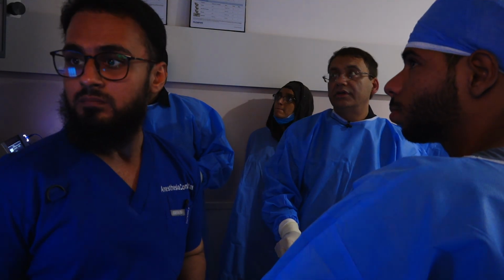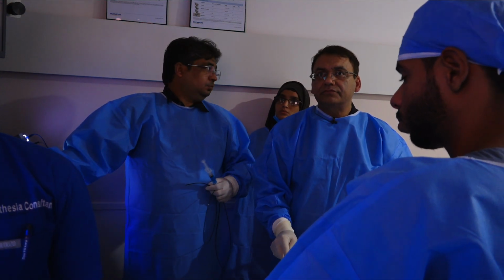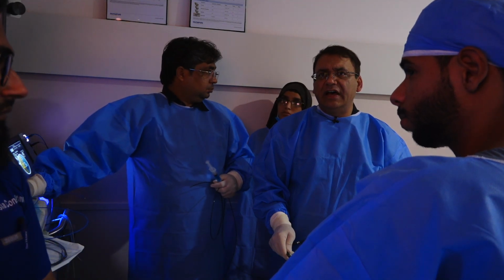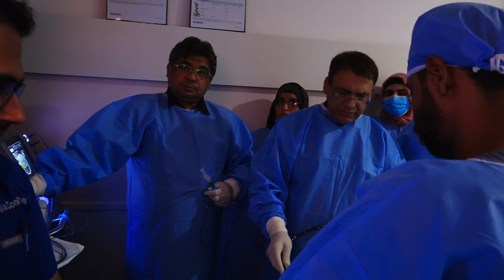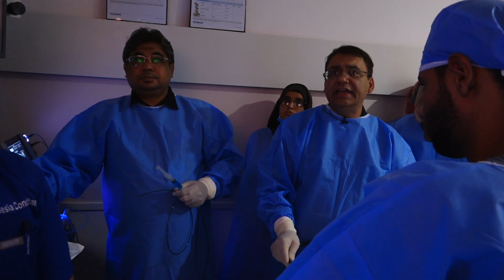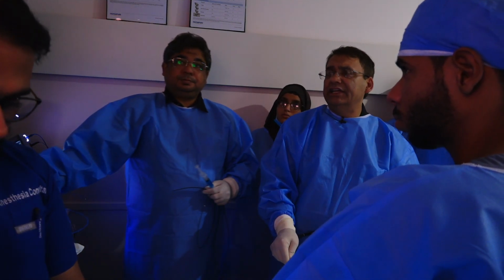Khalid, Assalamu alaikum. We are with you. Walaikum assalam. Okay. So I don't know if the case has been presented yet or no. No. Okay. So I can just give you a brief of that. This is a 32 years old, and he had a dysphagia, and overall manometry, everything is suggestive of type 1 achalasia.